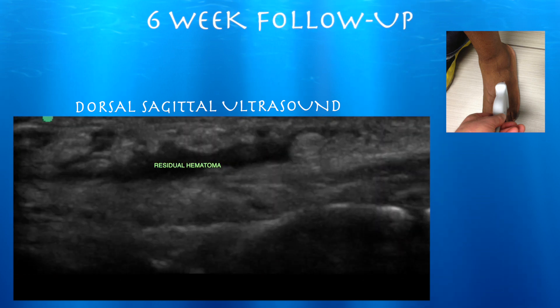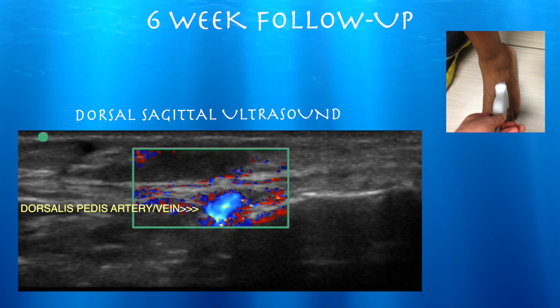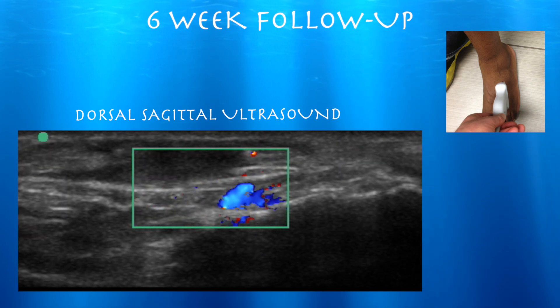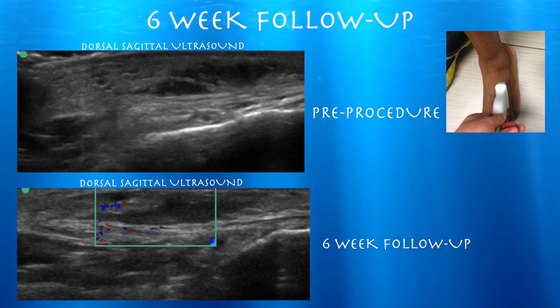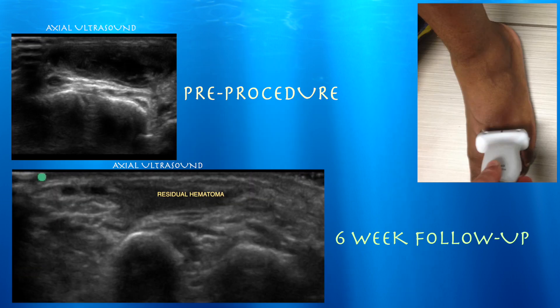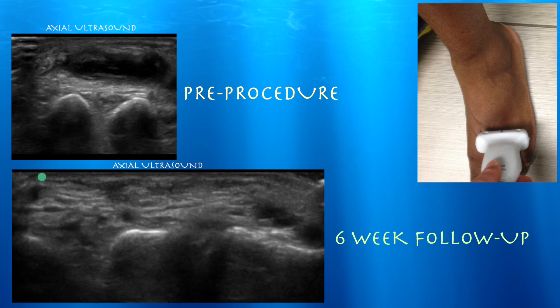Here we are at six weeks. You can see that hematoma is starting to get a little lighter, consistent with some solid tissue forming in there, but it's certainly smaller. You can also see how close you are to the vascular structures right underneath it. Here's a comparison of six weeks versus pre-procedure — it's much smaller and it is organizing.